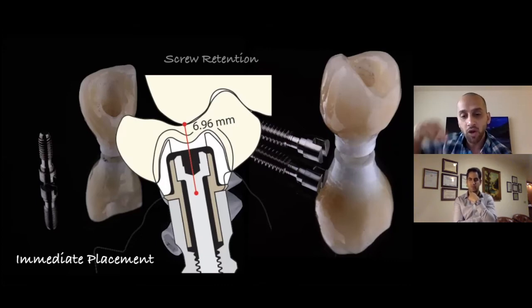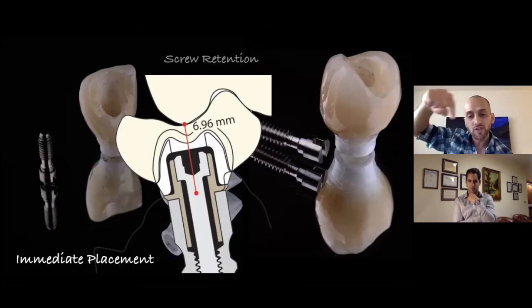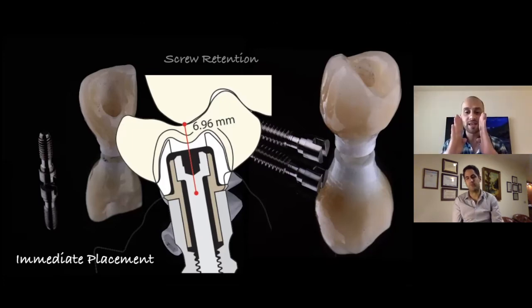composites, and also beveling the top of the screw access. So if the screw access was like this, we were beveling the top a little bit by being able to trim the top of the screw access hole, and then you would cover that with some opaque composites. But today, because we have monolithic zirconia crowns, and because it's one solid crown with no layered porcelain, they are so strong that we can make the whole thing out of zirconia. So I think that problem has been really fixed, because not too many people do PFMs anymore.